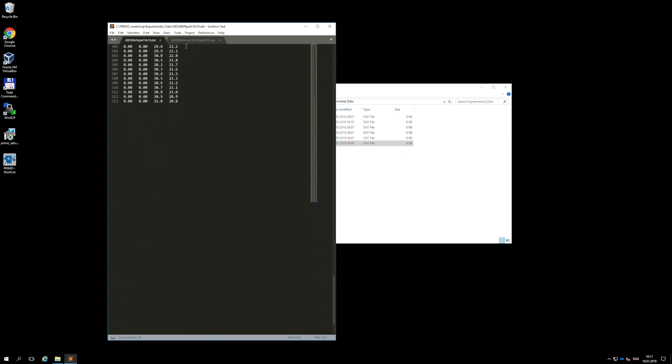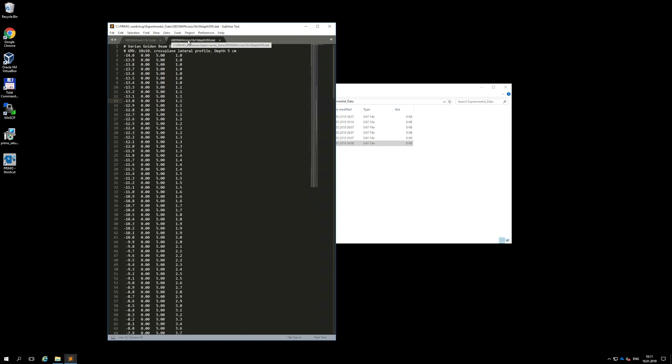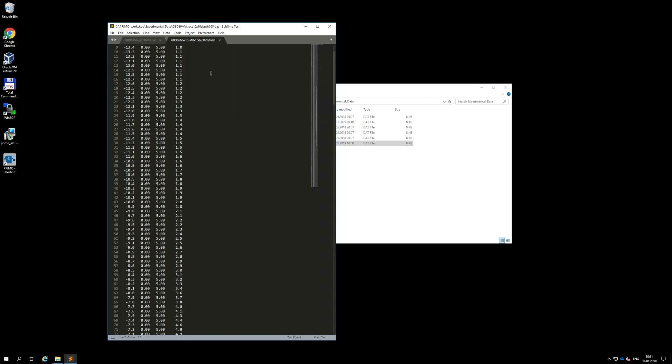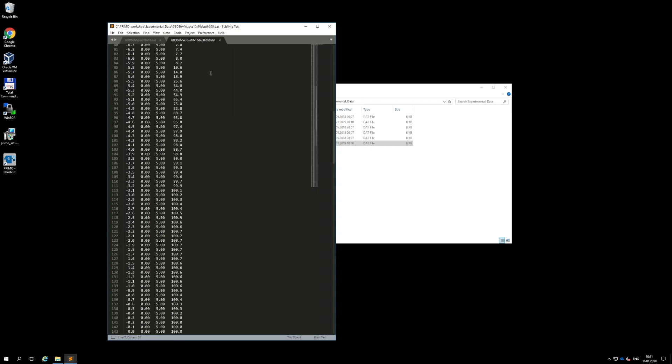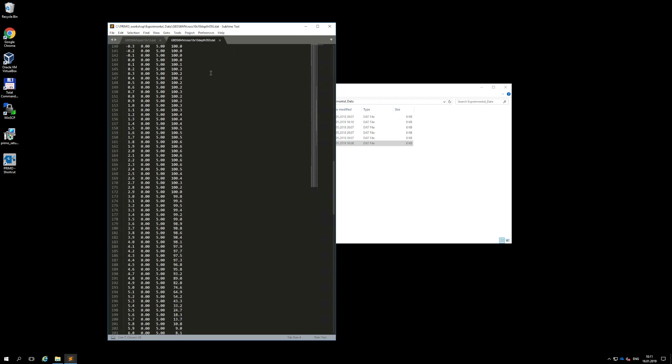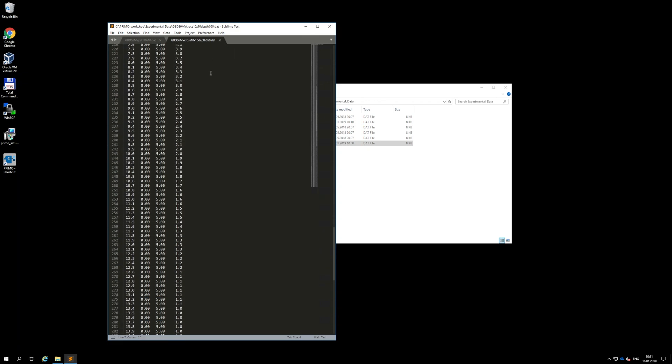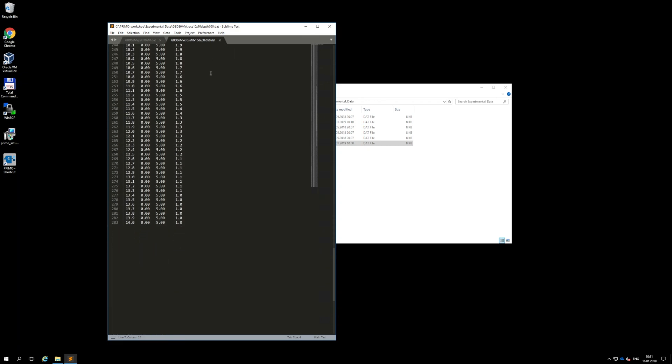A centered lateral profile taken along the x-axis looks like this, with x values varying from negative to positive numbers. The depth at which the lateral profile has been measured is given by the z coordinate, in this case 5 centimeters.